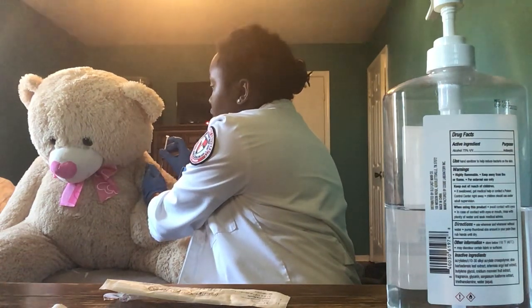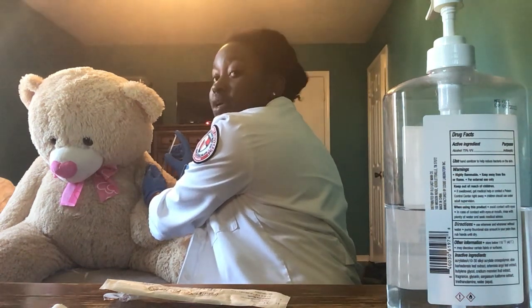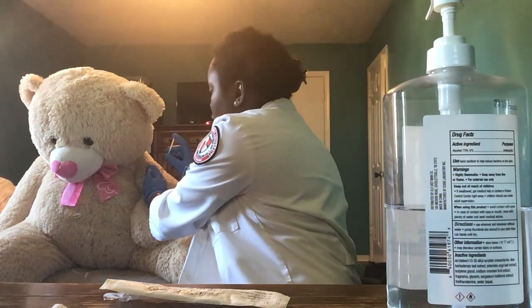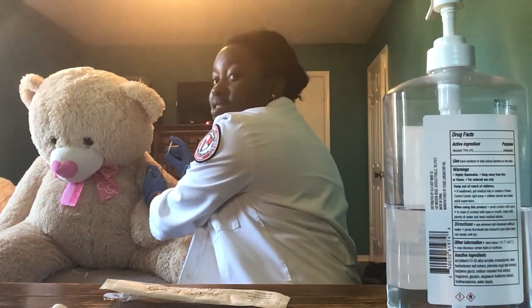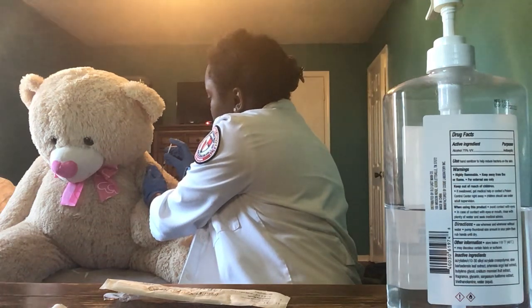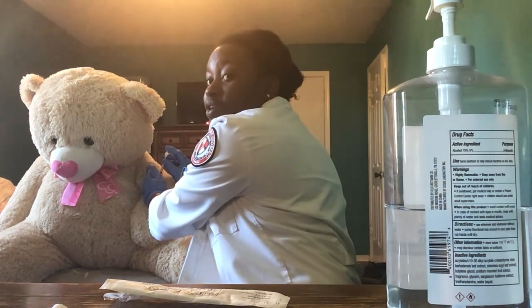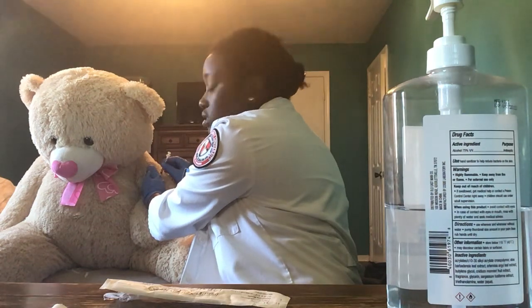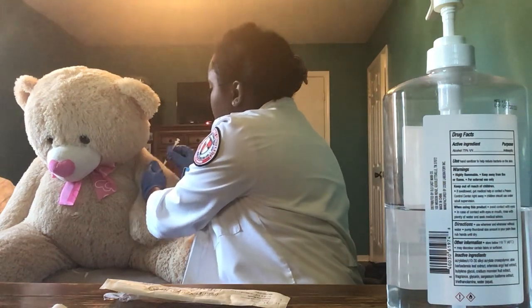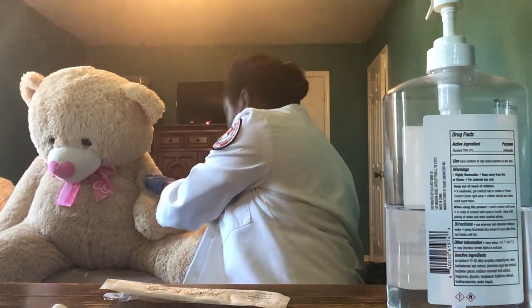Before giving it, I'm going to aspirate, so move the plunger up. And now I'm going to inject the medication. I'm going to inject it slowly, 1 milliliter per 10 seconds. Okay, once the medication has been injected, I'm going to leave the plunger in for a little while. Then I'm going to take it out and add a cotton swab and dispose of this in the sharps bin.